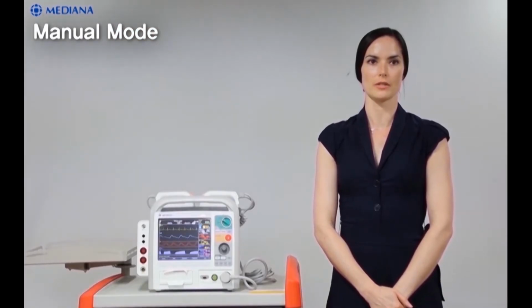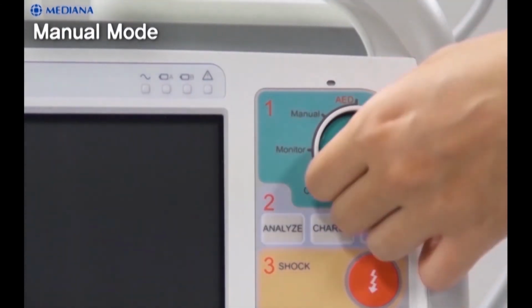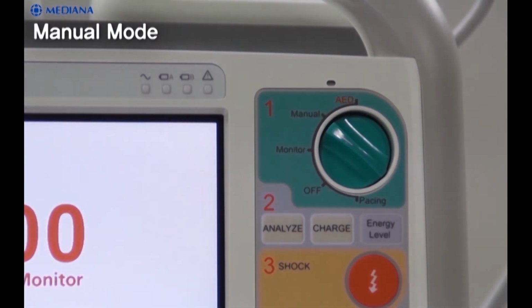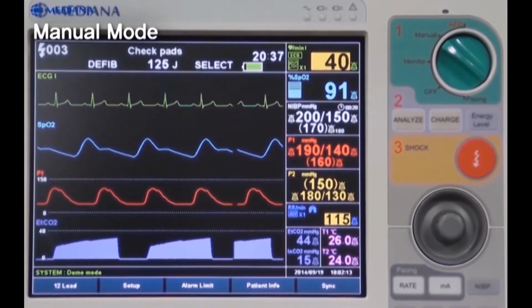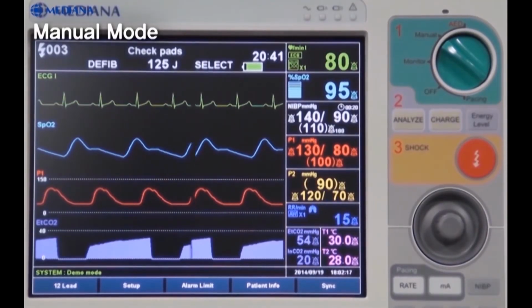Next, apply gel to the paddle electrodes. Put the paddles to the patient's bare chest and select the manual mode of the D500 by rotating the mode select knob. When the manual mode of the D500 is activated normally, the energy select display will be shown on the top of the screen and other parameter information will be displayed.